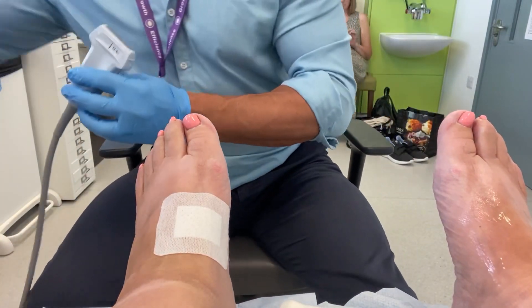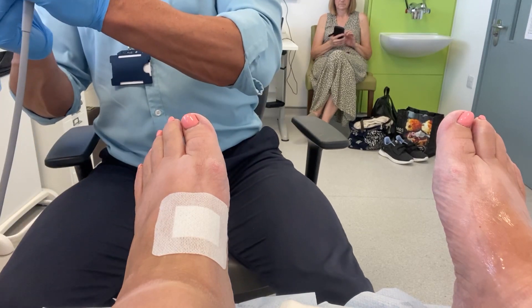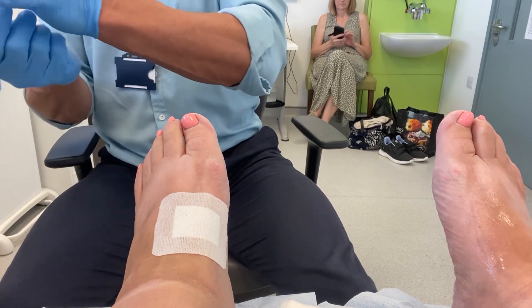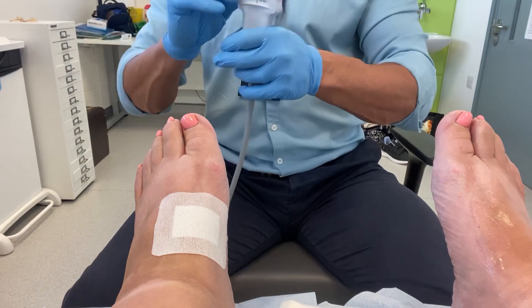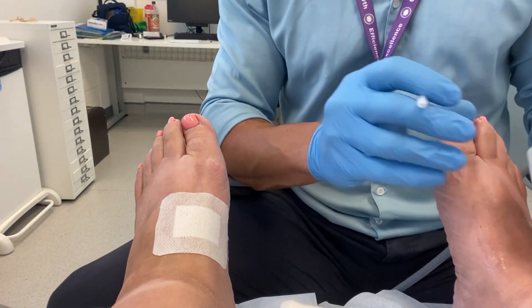This makes access to the joint capsule much easier. Remembering that the neurovascular bundle, or the dorsalis pedis, runs across the second metatarsal cuneiform joint, this is also a safer way of performing the injection.